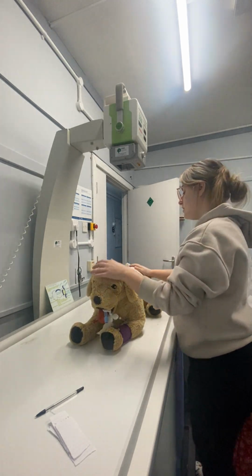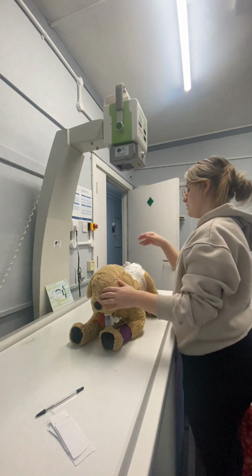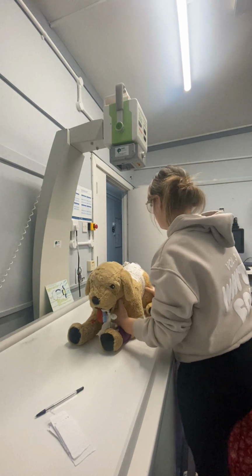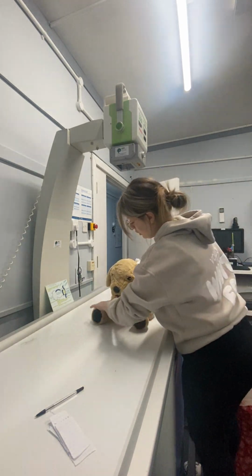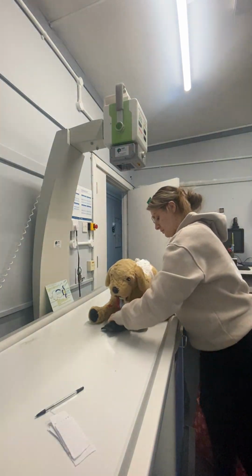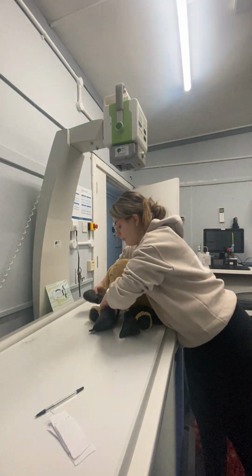And then if you're happy to help me to move him down towards this way, just so that his skull's in line with the tube head. So on 3, 1, 2, 3. Thank you. And then I'm just going to use some positioning aids. I'm going to use a sandbag over each limb.